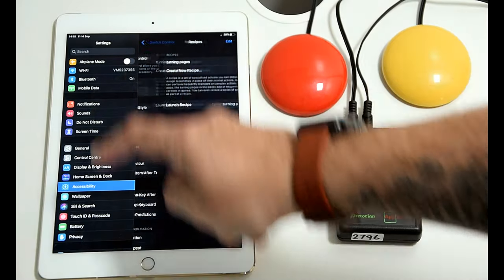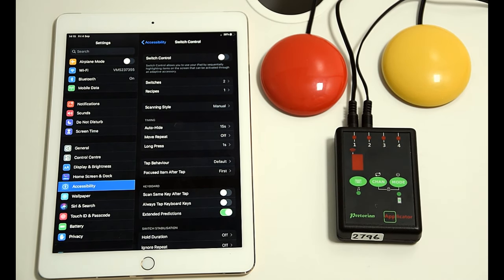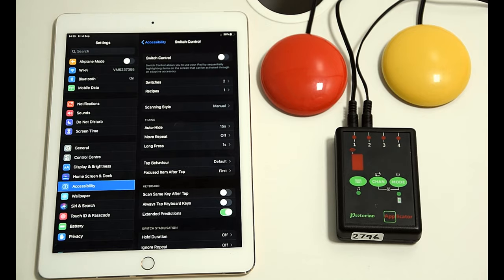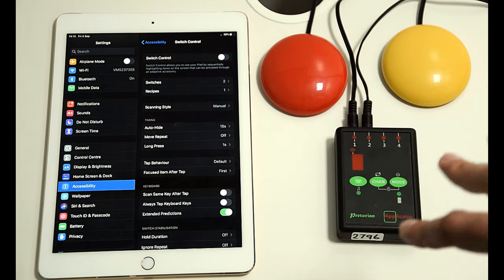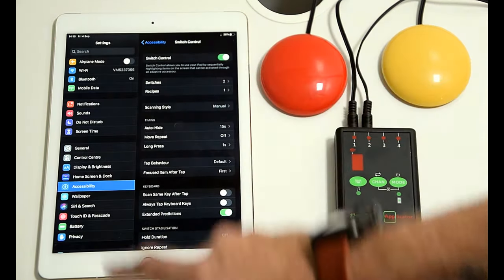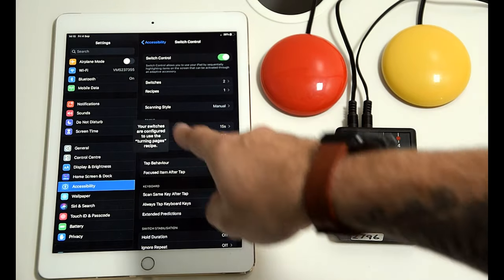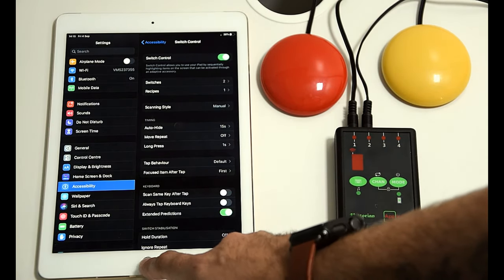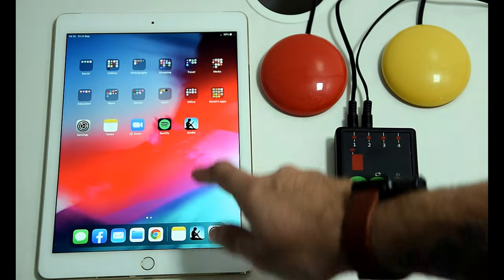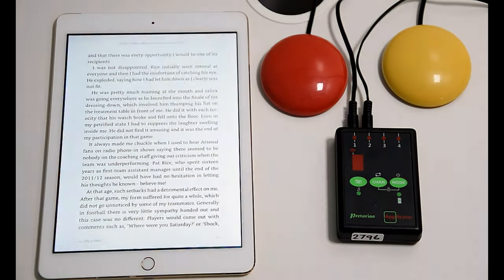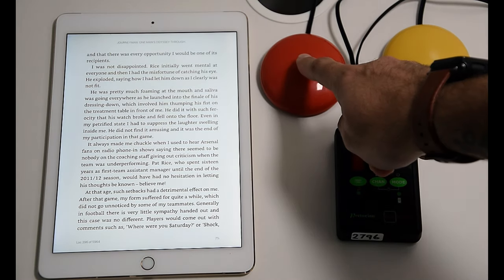Now what happens is switch control is still off. As soon as you put switch control on, the recipes take over. So what we're going to do now is go switch control on. You get this little message come up saying your switches are configured to your recipe you've set up and we'll show you straight into the Kindle app how that works.